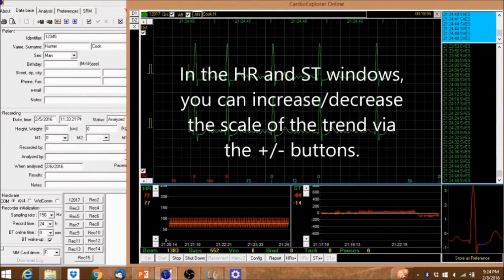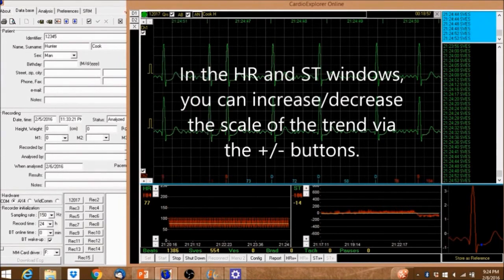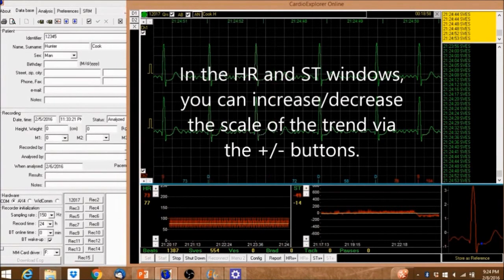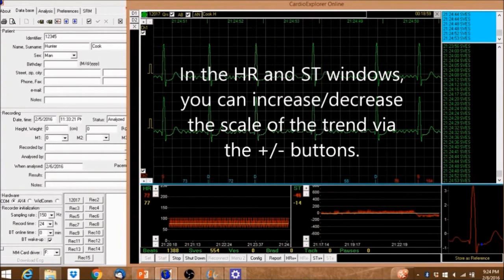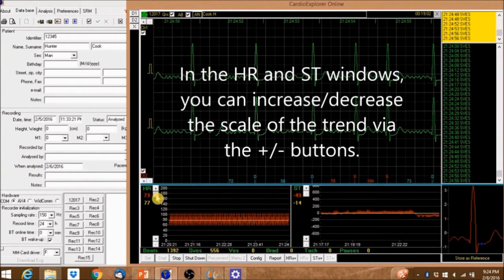In the HR and ST windows, you can increase or decrease the scale of the trend via the plus or minus buttons.